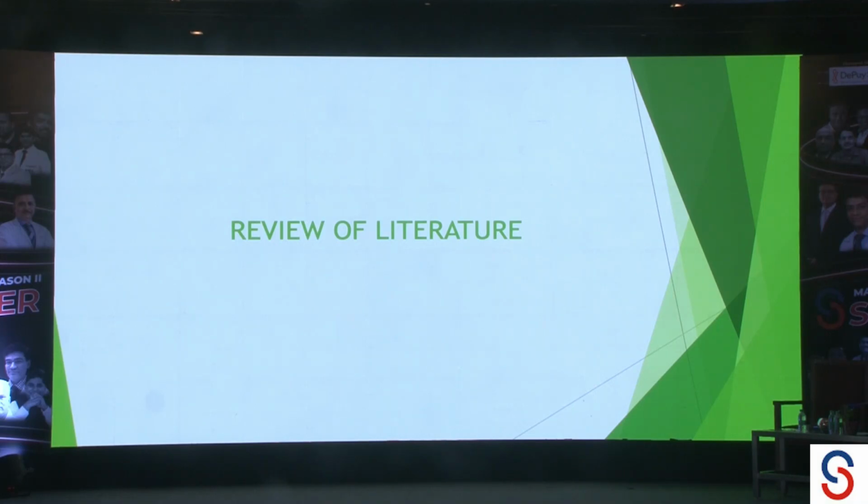Normally, we test soft tissue tension without repairing anything. Subscap normally is incidental. So normally once we put all the implants, we test the tension and dislocatability, and it must be reasonably tight, and then you repair whatever you can repair. So we are not dependent on repair for dislocation. Yeah, I got your point. But after 4 days, you could put such a thick spacer in between.